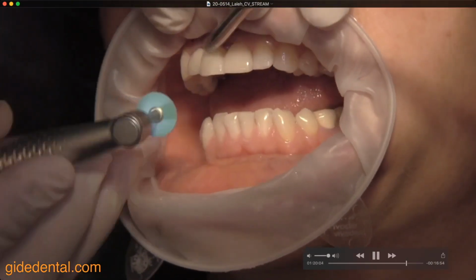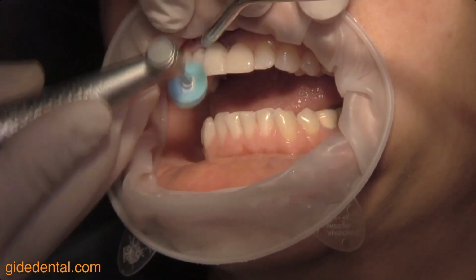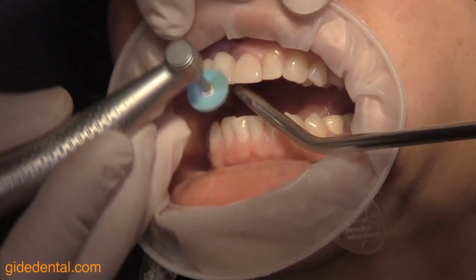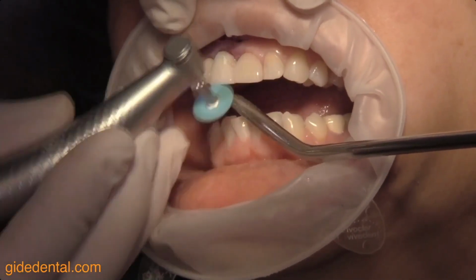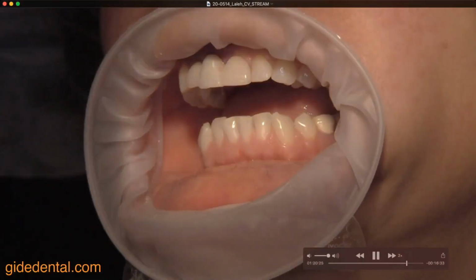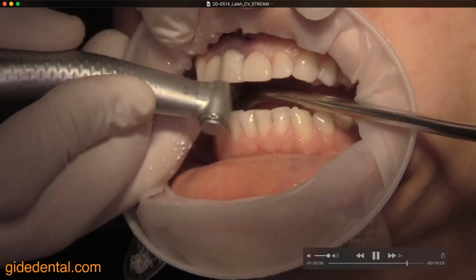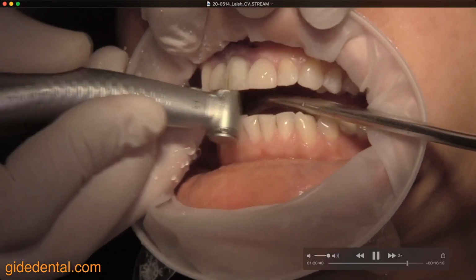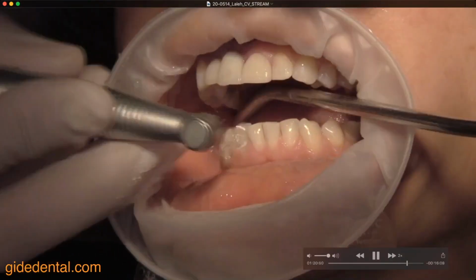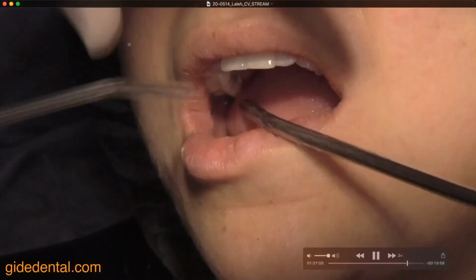More composite was placed around that tooth outside of the oral cavity, on the lab bench, then adapting it to the dimensions that we need for this tooth, making sure that, of course, it follows good functional aspects, no occlusion because it's an immediate tooth replacement, and also in protrusion and in lateral. So this is very carefully done.